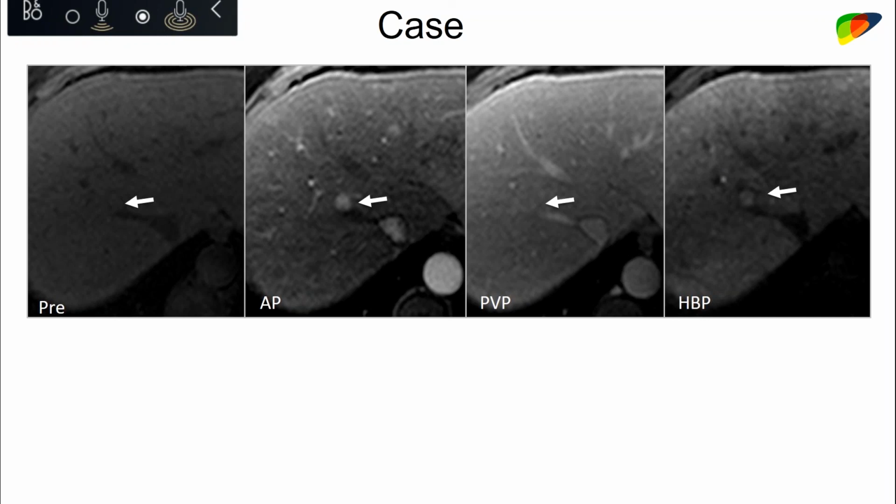My question is, if it is there, will you change your opinion about this lesion? Would I change my opinion? Well, it wouldn't change my categorization of this nodule. I'm highly suspicious that it's an HCC. I think it will increase. It may increase your suspicion, not decrease it.